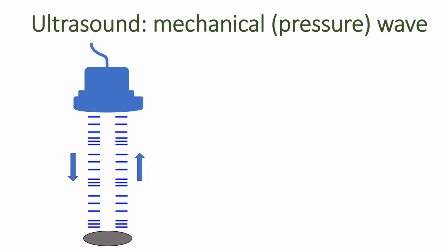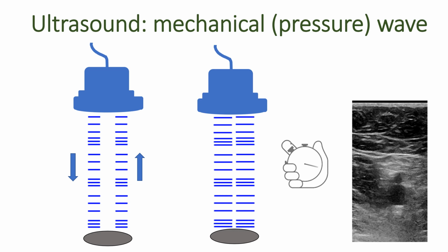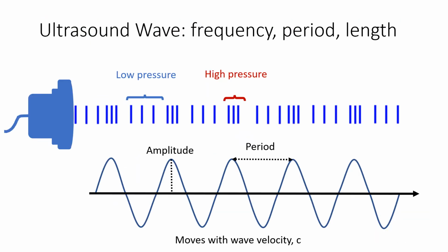An ultrasound image is constructed by emitting a sound with frequency higher than 20 kHz and receiving the echoes from different tissue structures called reflectors. By measuring the time between emission of the signal and receiving of the echo, an ultrasound system is placing pixels of different brightness at different depths, creating an image of the tissue. This is the brightness mode, or B mode, of ultrasound imaging.